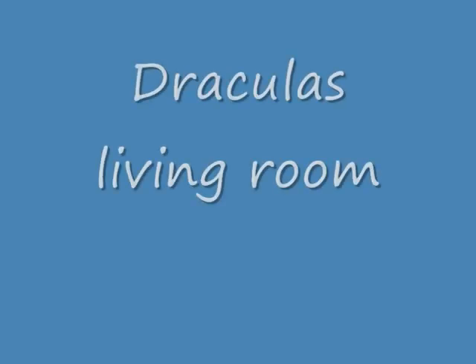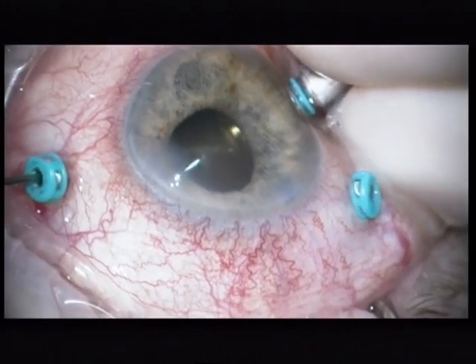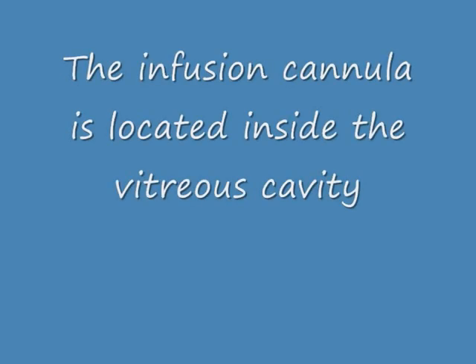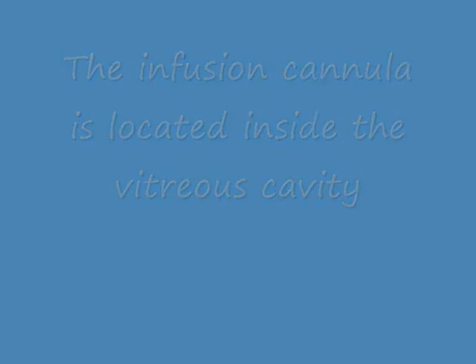In fact, also on the iris. Now we can see the vitreous with a very, very dense hemorrhage. It looks like Dracula's living room. This is the status two months after injection with RTPA and gas. It's important to check the infusion cannula, and you can see that the infusion cannula is located inside the vitreous cavity.